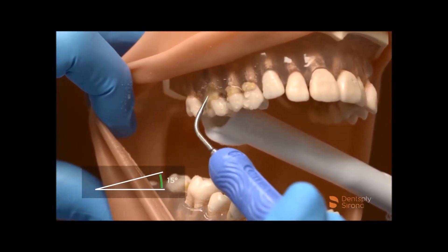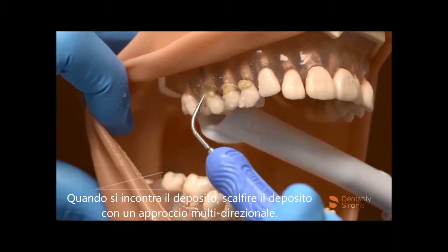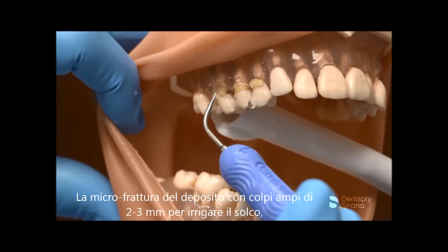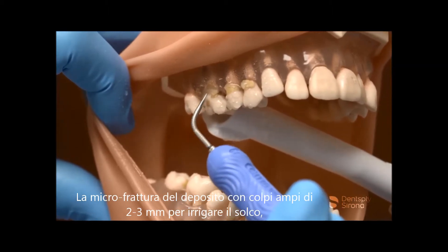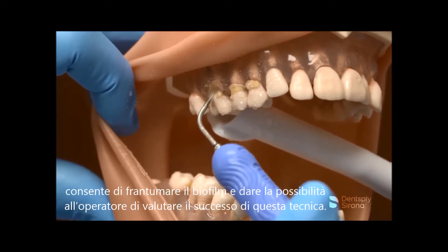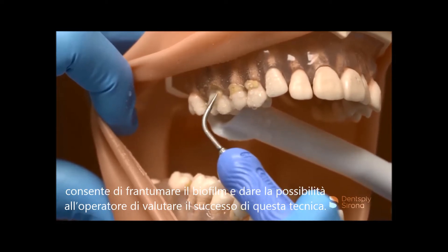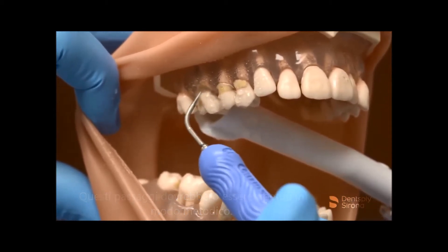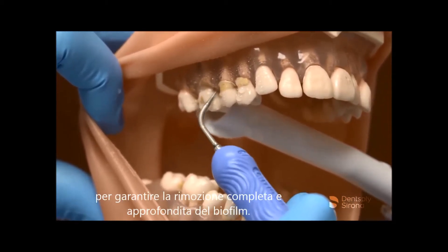When calculus is encountered, tap at the deposit in a multi-directional approach. Micro-fracturing the deposit and following with 2-3 mm sweeping strokes to flush the sulcus disrupts the biofilm and allows the clinician to assess the success of this technique. These steps should be repeated in a methodical, channel fashion ensuring complete removal and thorough biofilm disruption.